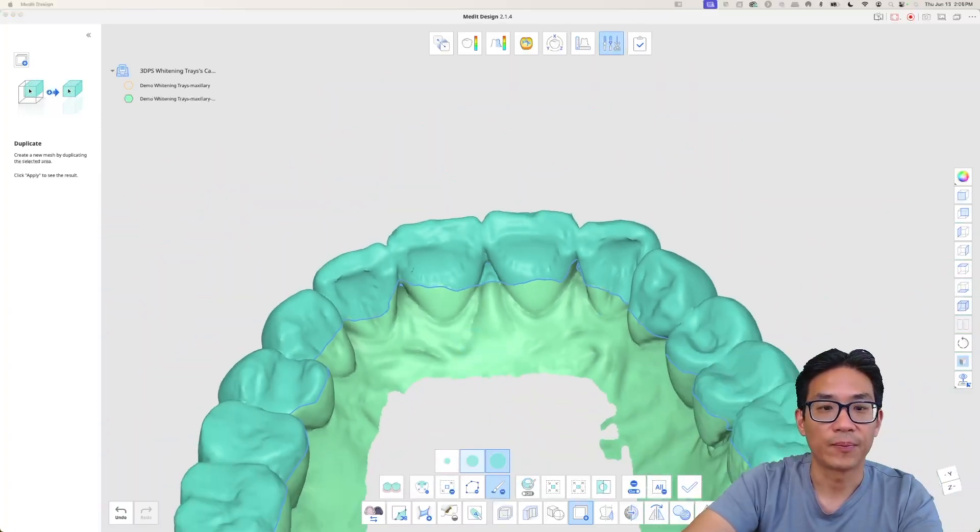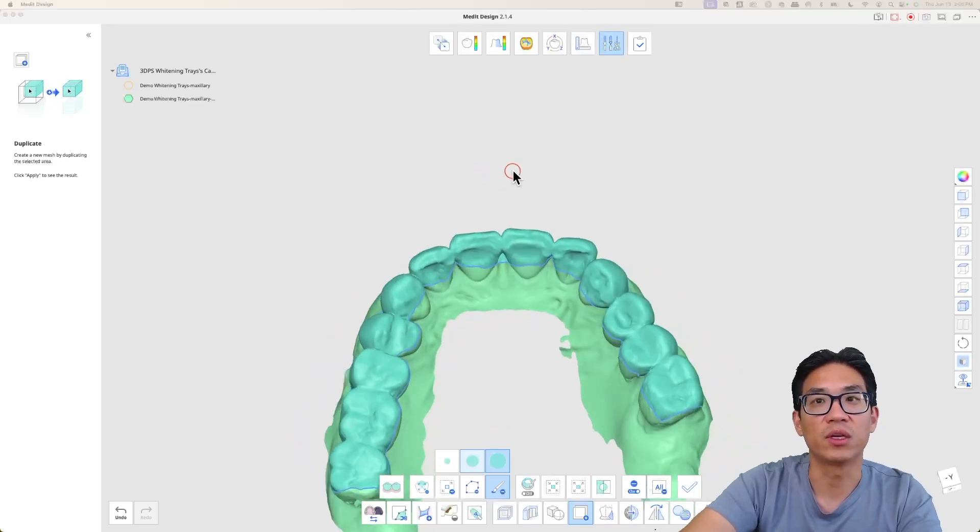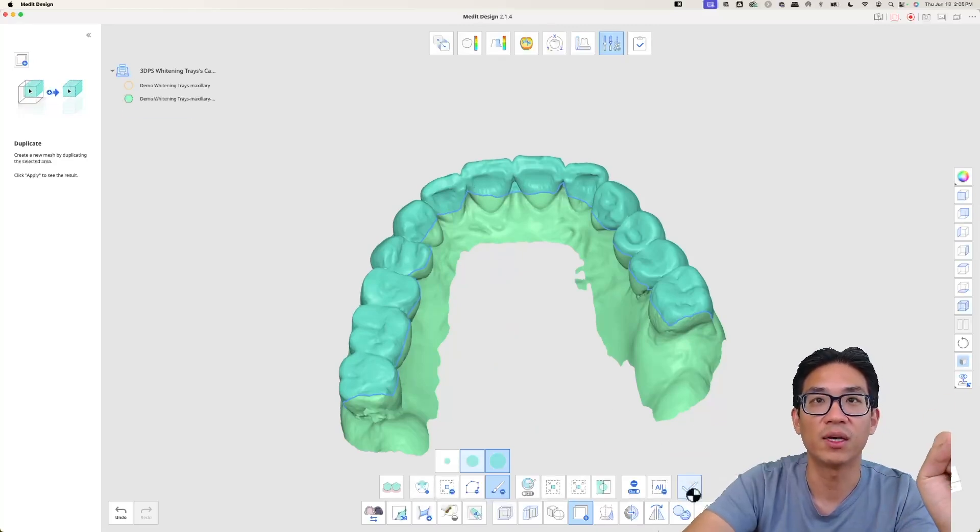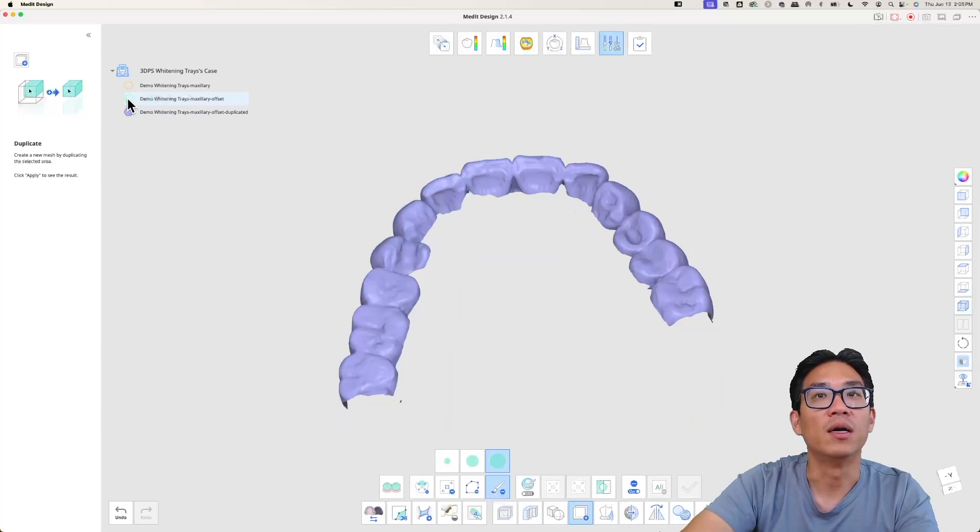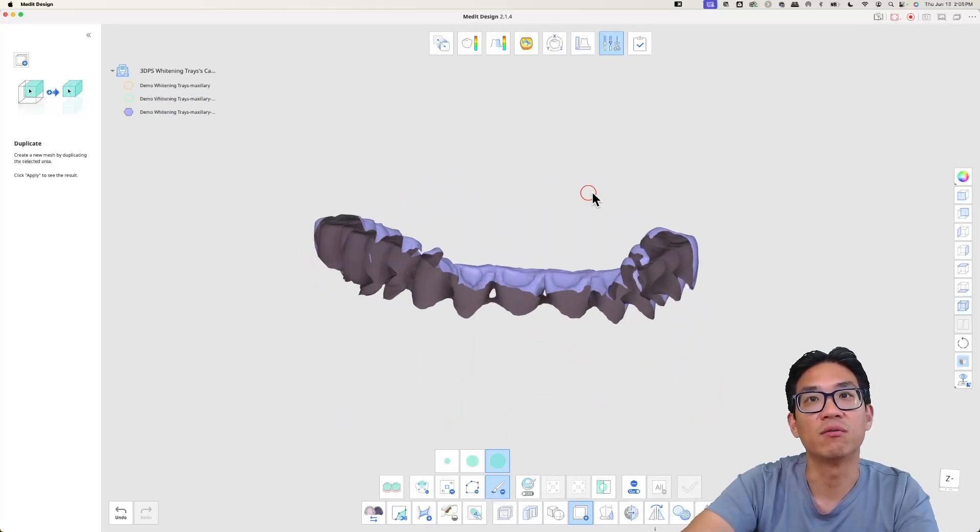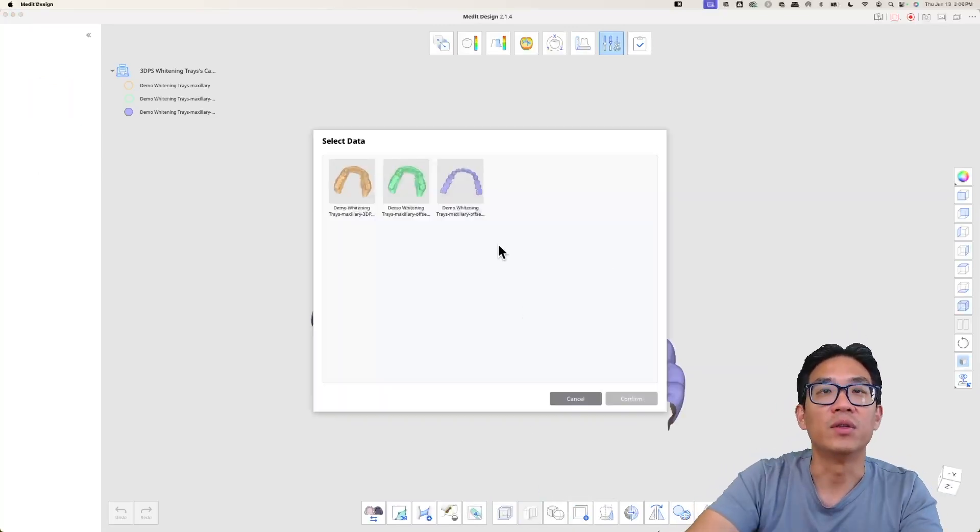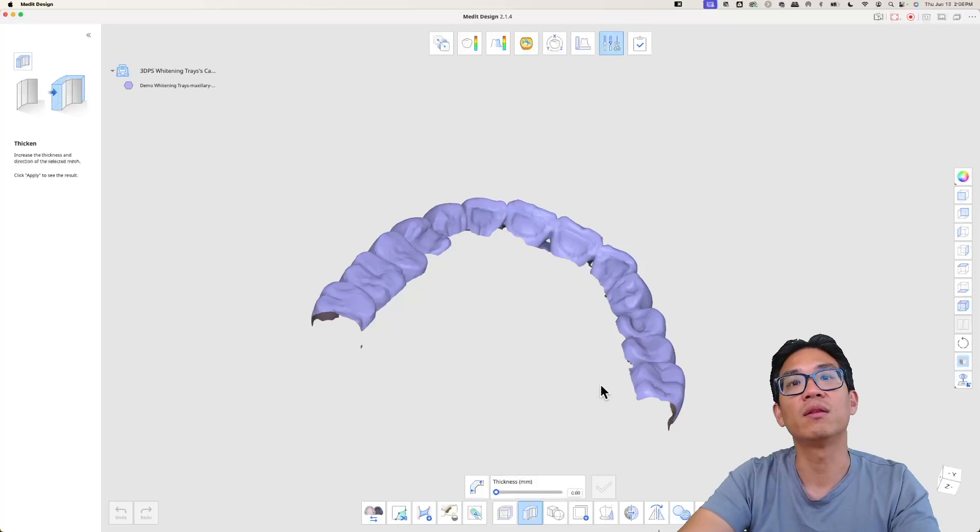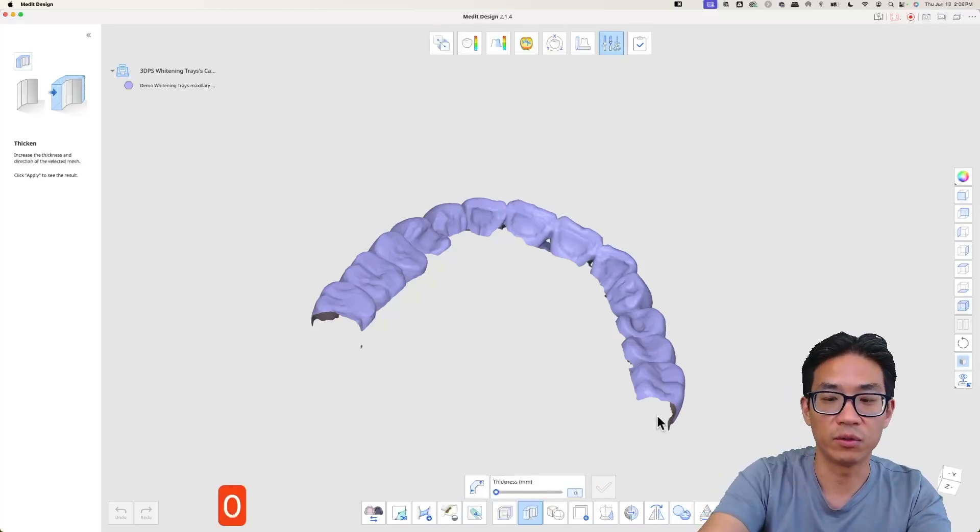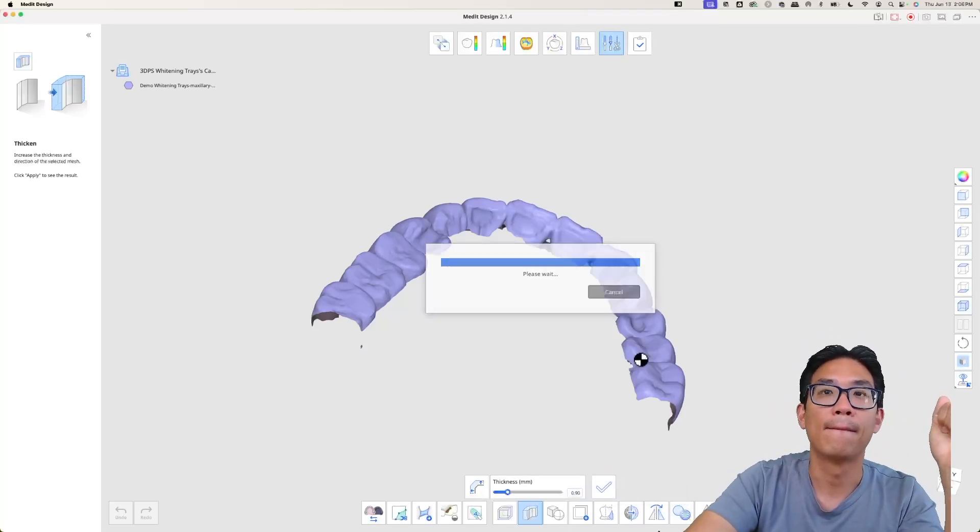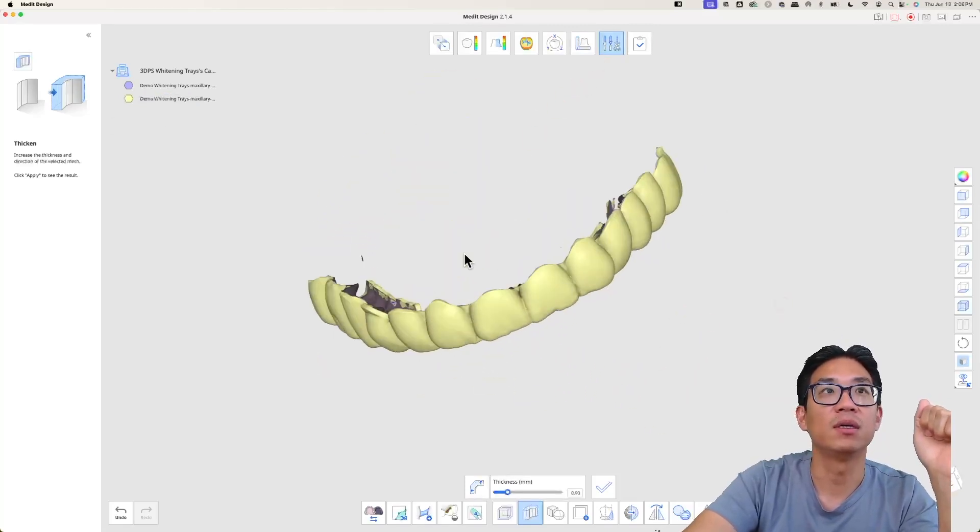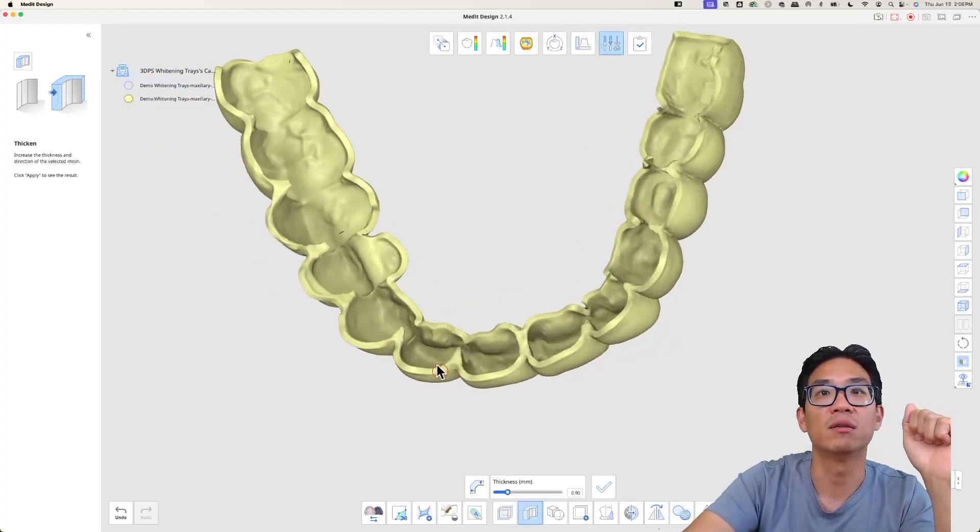So that's basically the duplicate function where I'm telling the software, the area that I've selected I want to duplicate. Now I hit apply and now it's been duplicated. We want to thicken, so now we did a 0.1 offset and now we want to thicken it to 0.9 millimeters. We hit the thicken button and we're doing 0.9 millimeters and hit check mark. Here is the whitening tray.